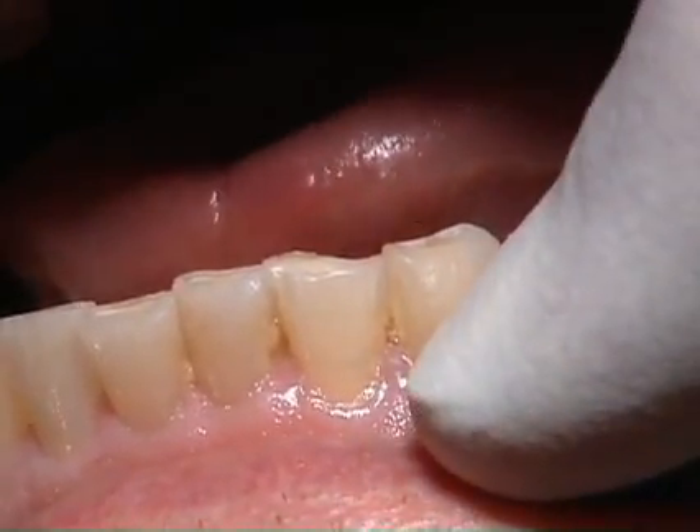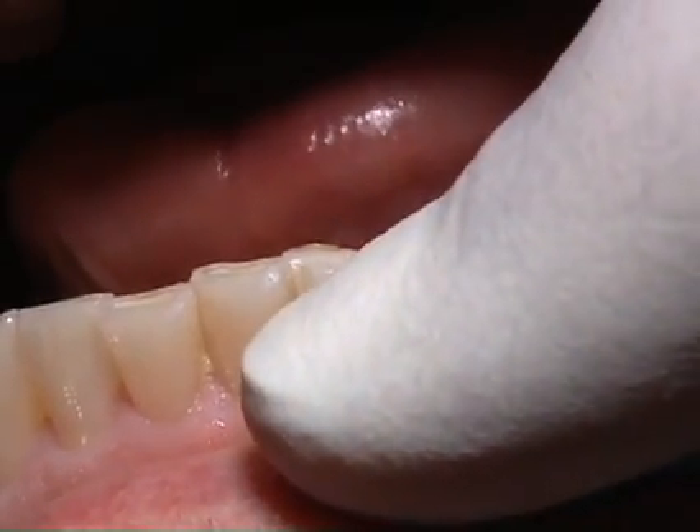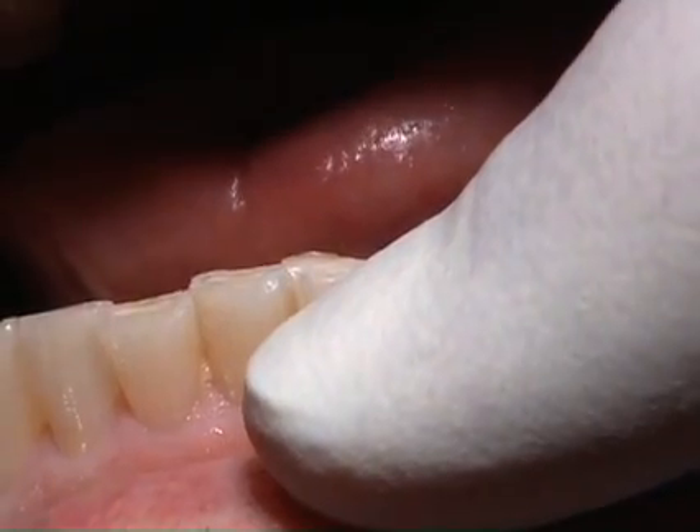Our goal is to go through and build back up the incisal edge of 22, create proper canine guidance, and then allow better protection for the incisal edge of number 23.